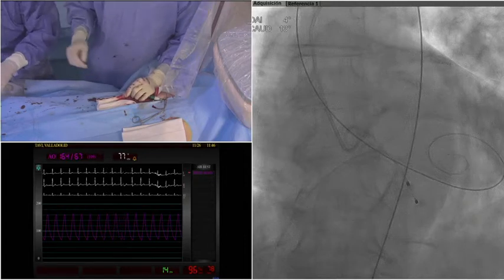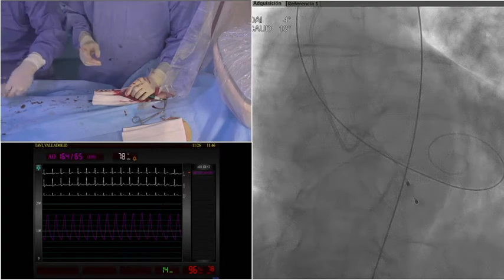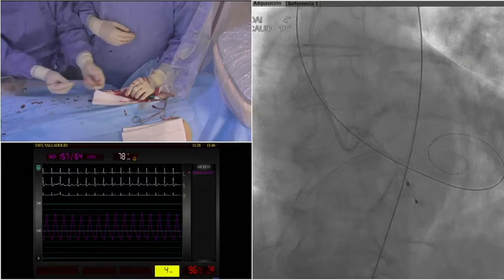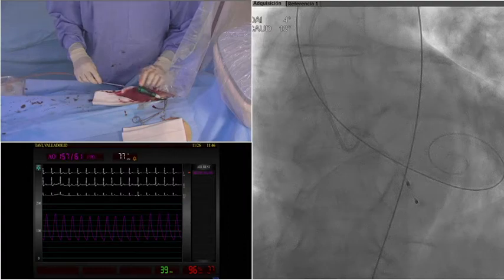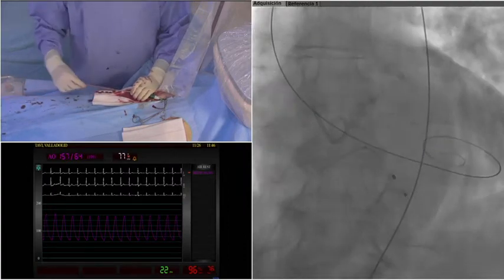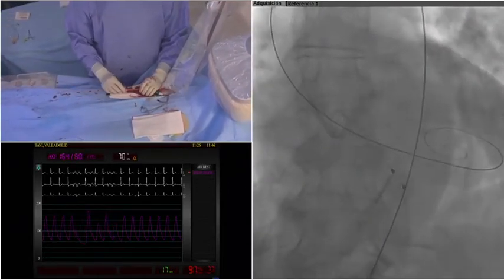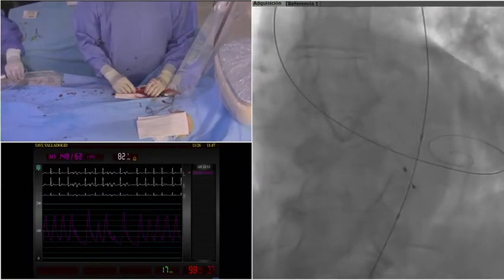So now, if you can see us, we are advancing the Mammoth balloon. It's a very flexible balloon. It's compatible with how many French? I don't remember. It's compatible with nine French. So we already have the Python in place, but we could do a valvuloplasty, for example, with this balloon. And as you can see, it's very flexible. And what balloon size? It's 20 millimeters. This is a non-aggressive predilation. Okay, fine. You can see here the balloon.